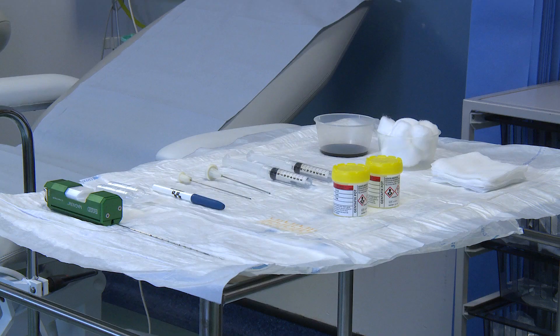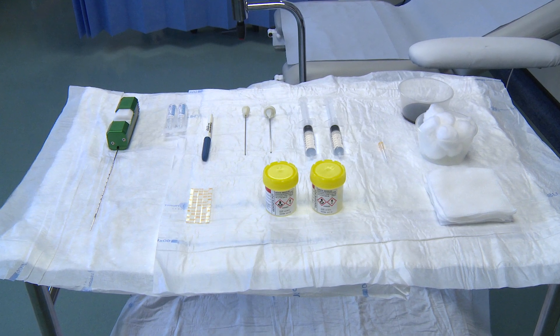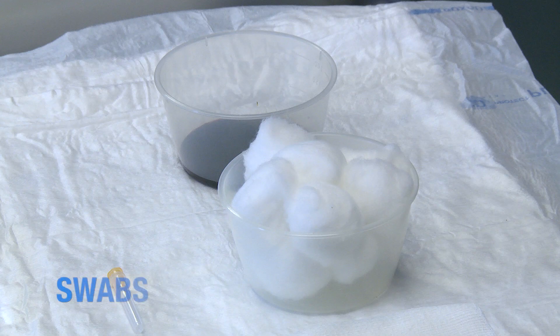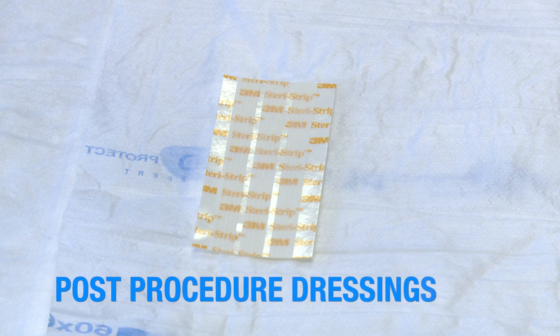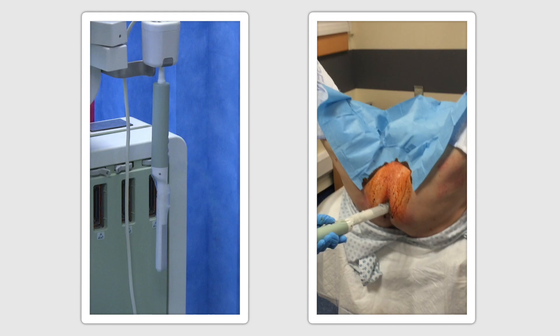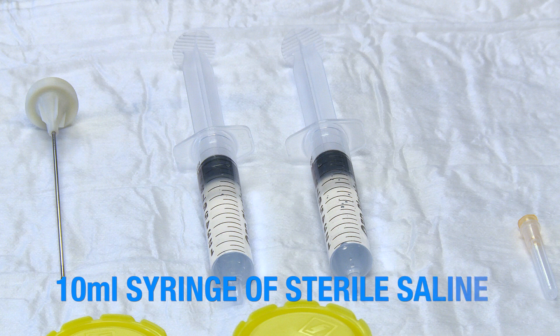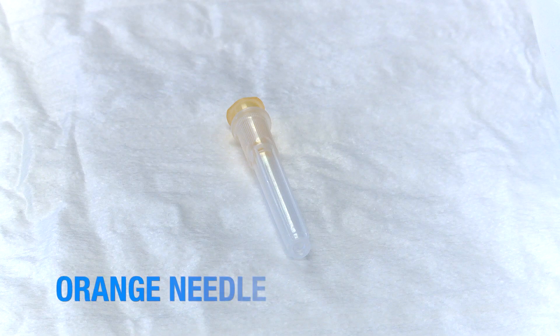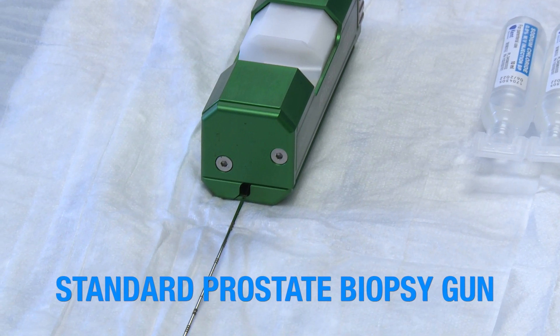The equipment required for the CAMPRO biopsy method is very similar to that already used for transrectal biopsies. The standard sterile area consists of swabs, antiseptic wash, biopsy cassettes to receive the samples, and post-procedure dressings. A linear transducer endocavity probe is used and is available in any unit that performs prostate biopsies. A 10ml syringe with 1% lignocaine is kept on the tray, as is a 10ml syringe with sterile saline. An orange needle is also required, and a standard prostate biopsy gun deploying an 18 gauge needle is used.